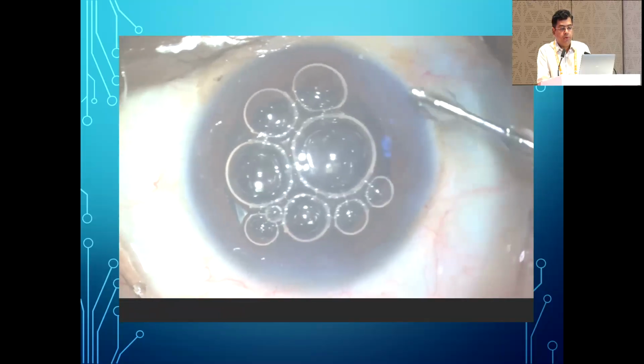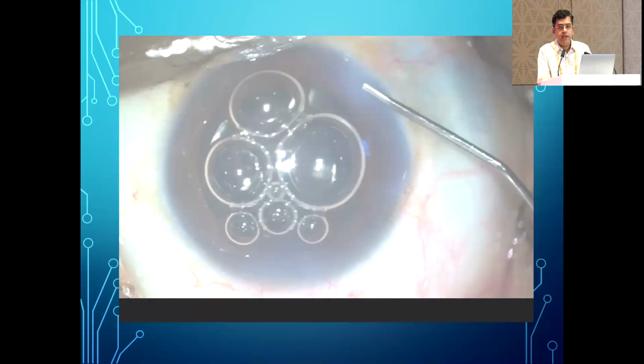And the most important thing is, if you find that the anterior chamber is shallowing a little bit, it is always better to fill some air. This is very, very important in toric lenses and trifocal lenses because there is no post-operative shallowing. So you don't get inadvertent optic capture or little misalignment or decentration of the lens.